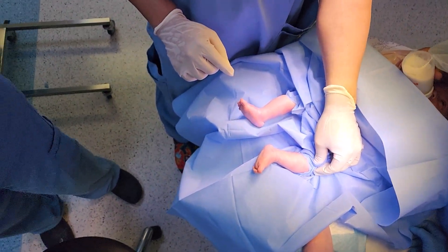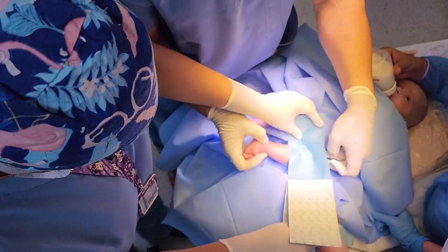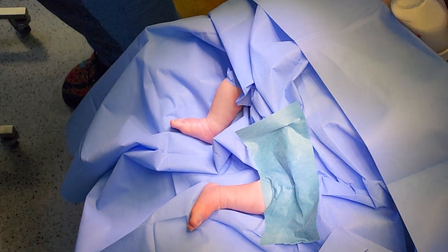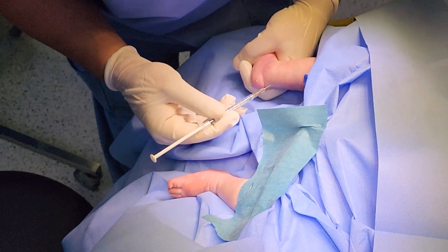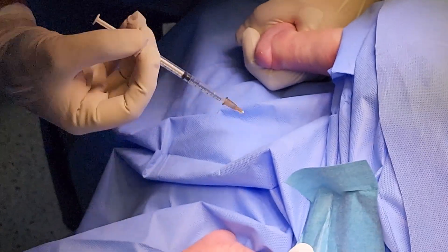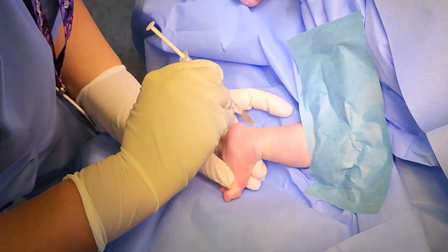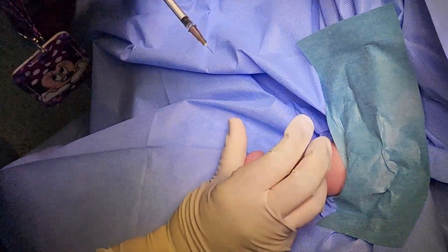We prepare the theatre fully before the child arrives. It should be warm and we play some music. The parent usually sits near the child's head, feeding them and keeping them calm. We prep the skin with chlorhexidine, then drape from the knee below. We use an insulin syringe with the maximum volume — usually 1ml is enough and we put it on both sides. Putting in local anaesthesia can make feeling the tendon a bit more difficult, but if you then massage the area for 5 to 10 minutes it usually dissipates the fluid.